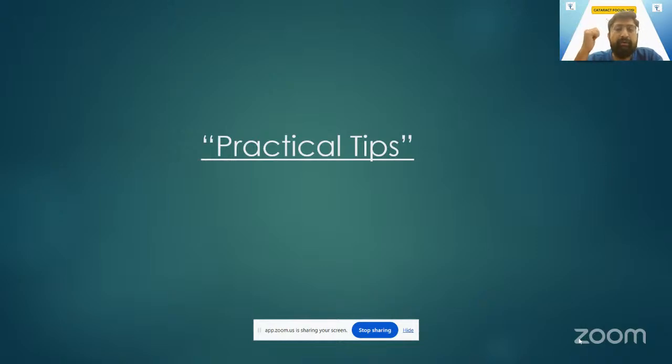Two things come into action with a side port: the way you enter it, and the second instrument you use. A lot of institutes advocate using a bud to stabilize the eye. Some mentors advocate a tooth forceps, a Lims, whatever you are comfortable with. But yes, a side port is important.